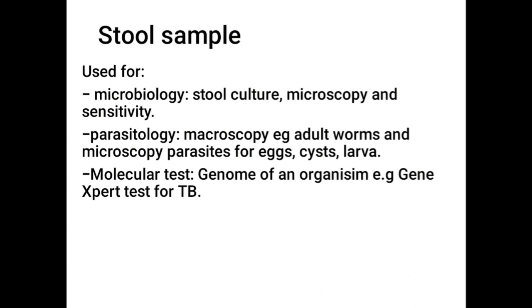Stool can also be used at molecular level, where we look for the genome of an organism, e.g. GeneXpert test for tuberculosis bacilli bacteria.